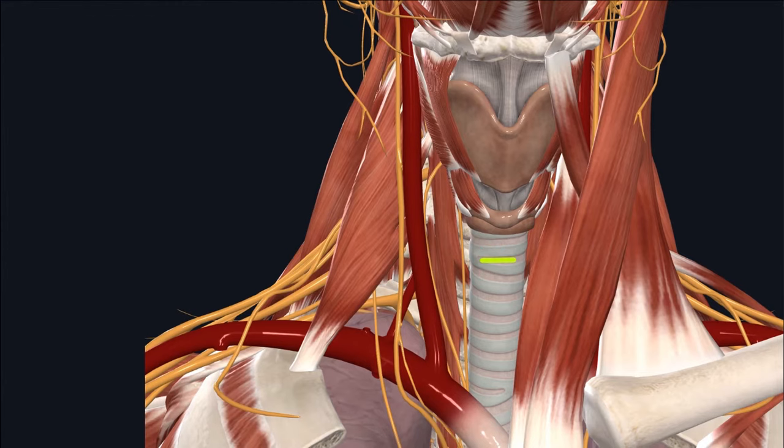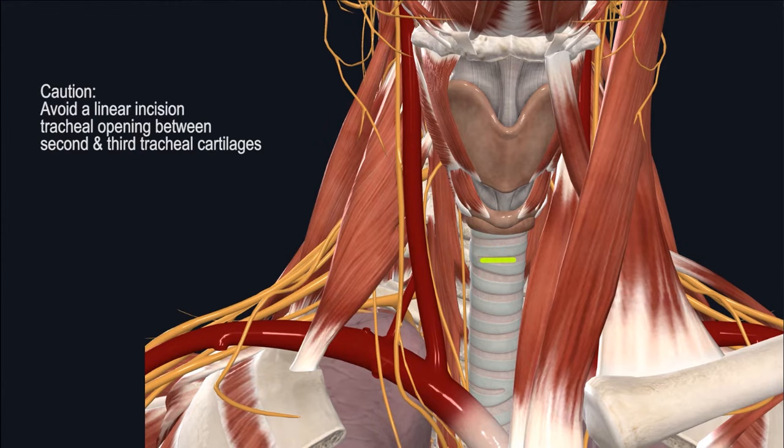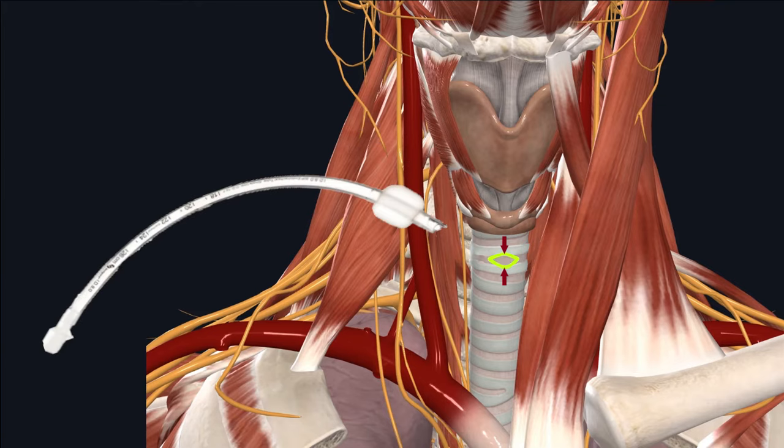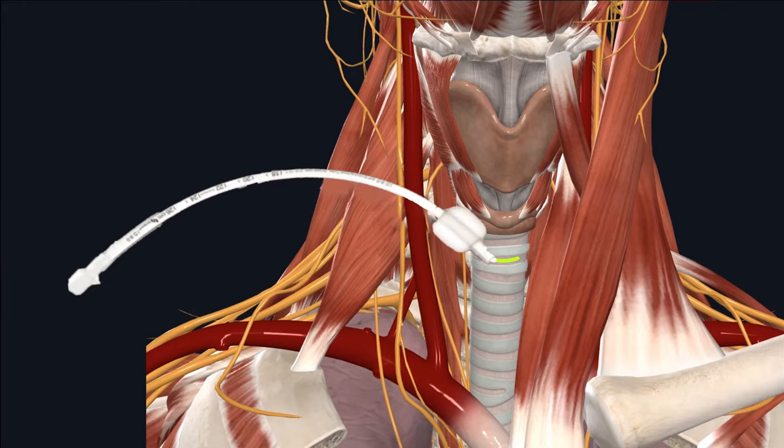Based on my past experience, one approach I would not recommend is using a linear incision between the second and third tracheal rings. Because a portion of the anterior tracheal ring has not been partially removed, once the tracheal opening is no longer stented, it will collapse onto itself. So if the tracheostomy tube gets dislodged by accident, it will make placement back into the airway that much more difficult.